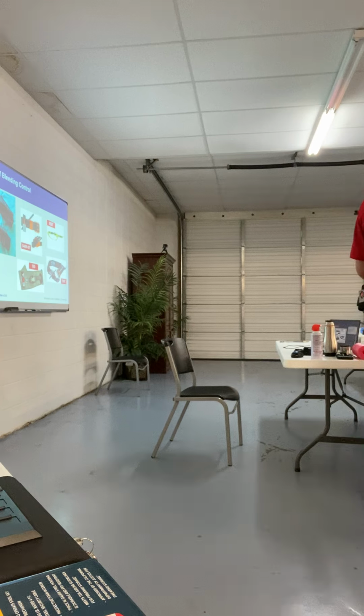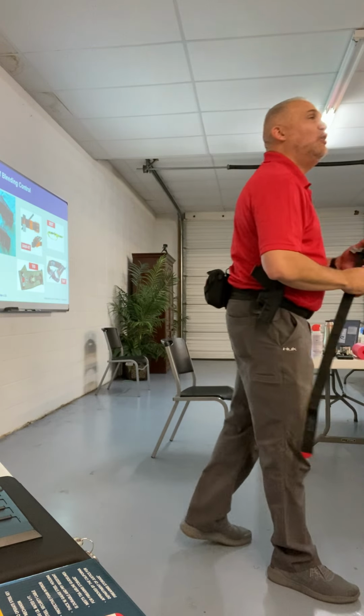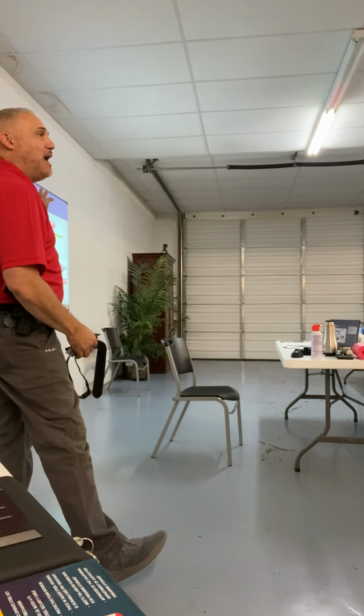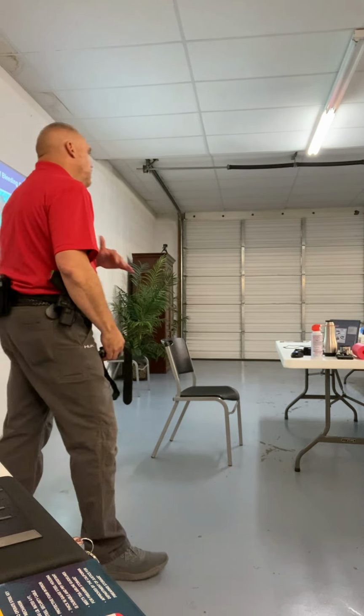They might look like it, but they don't have a rating for different tourniquets. Like, you know, when you go on, they go, oh, that's a 150 rated. So TCCC is going to have these five that they recommend, and then they'll have a ton that they don't recommend. So anything that's not on their recommendation level, I wouldn't even entertain it.